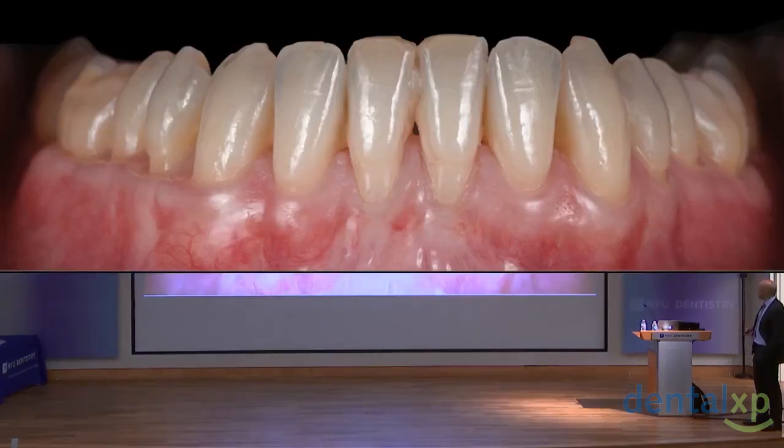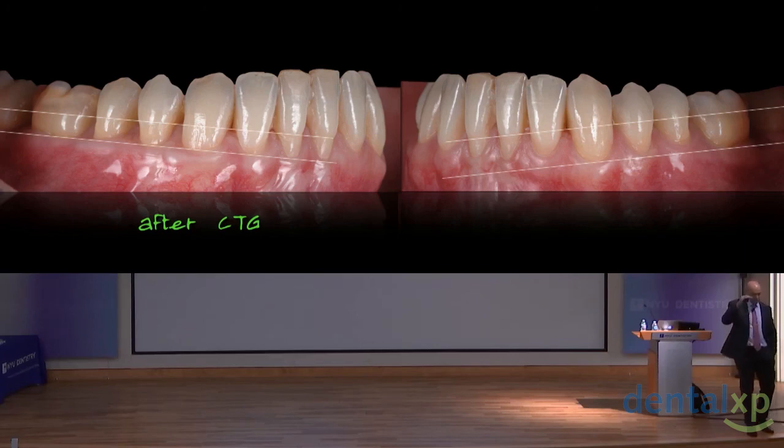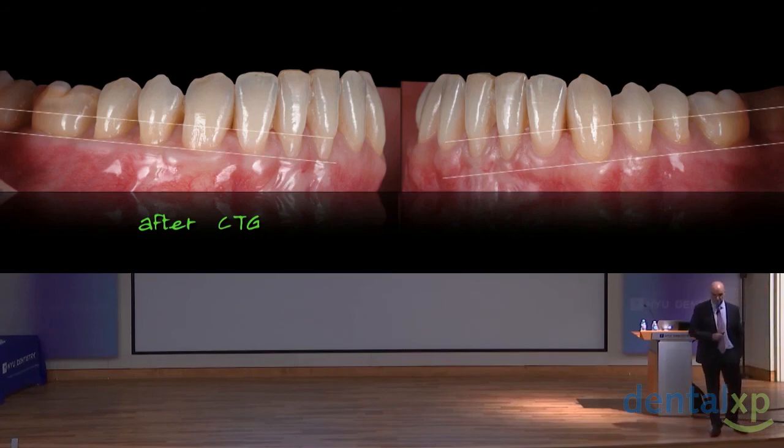So this is the result. Let's compare. Of course, the pinhole technique didn't work in my hands. It worked in the beginning, but not after months and months, not in the long term. But look at the connective tissue graft, and let's compare with the other side where we did the cuff plus the tunneling. You see that the papillae, the zenith, is better on the left. So in my hands, connective tissue graft wins, exactly like the literature tells us.